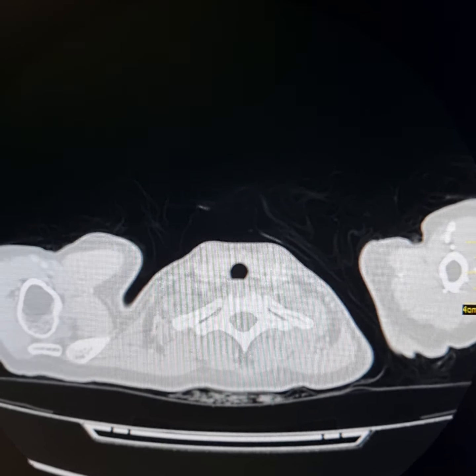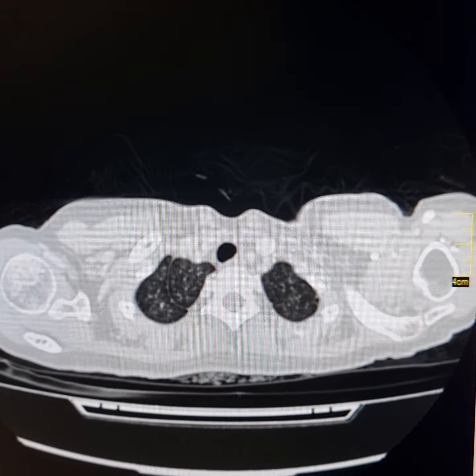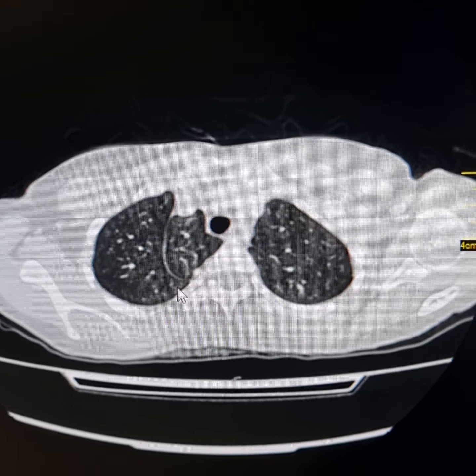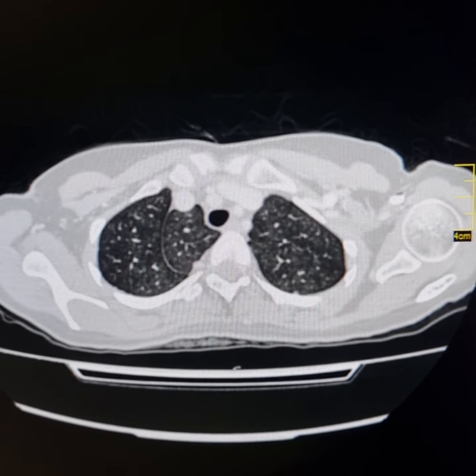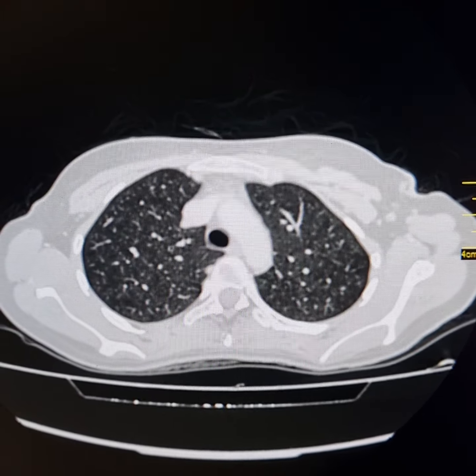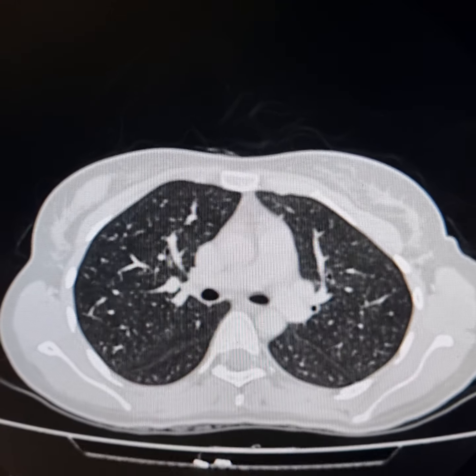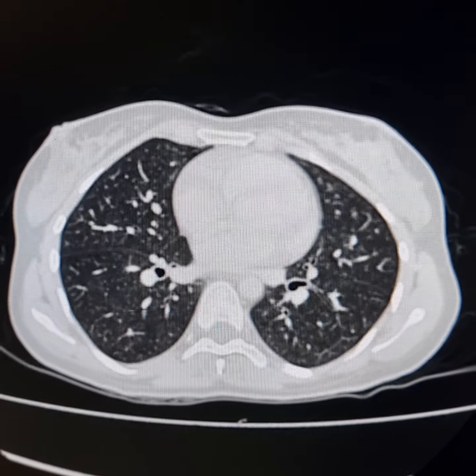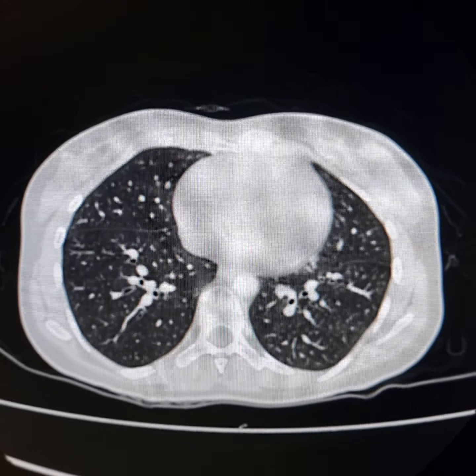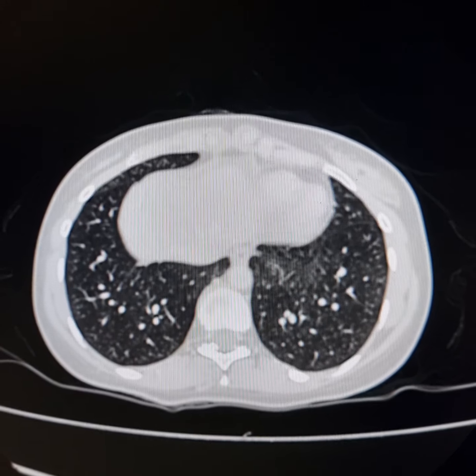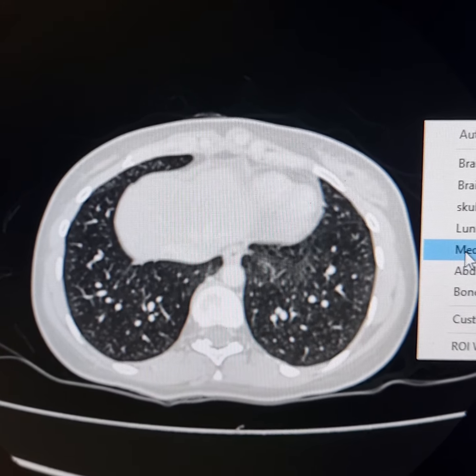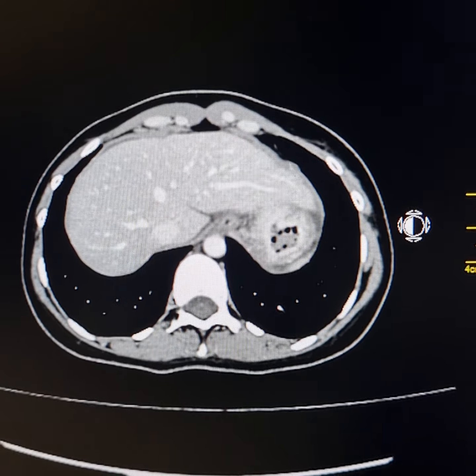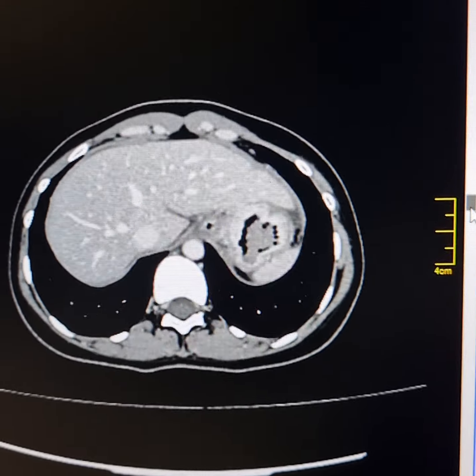This is a contrast enhanced CT scan of chest, abdomen and pelvis of a 25-year-old female. The patient complains of pain and discomfort in epigastrium, nausea, and there is a history of significant weight loss. On endoscopy there was antral gastritis. No mass lesion was present. Biopsies were taken which revealed adenocarcinoma.